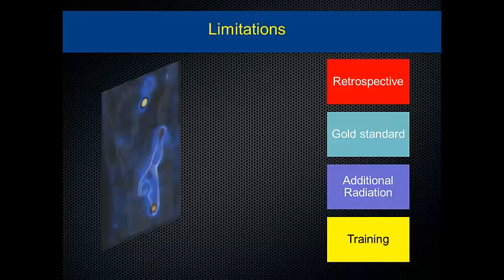And also the challenge is often they talk in terms of additional radiation. But the problem today in the world is as soon as a nuclear medicine physician asks for an extra scan, the whole world talks about radiation. But a radiologist does 10 CTs, nobody questions the radiologist. And also training is important. Training in cross-sectional imaging is challenging, but in oncology, I don't think so, because we are more used to oncological imaging and more or less we are okay with oncologic imaging. But my next bit of talk was about benign disease, where it is really challenging even for a conventional radiologist.